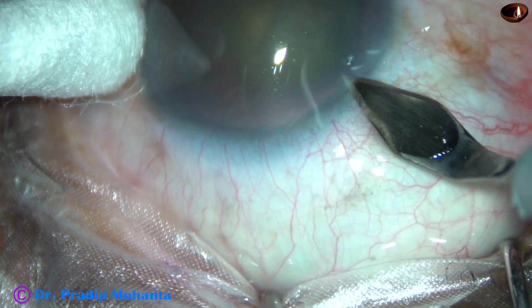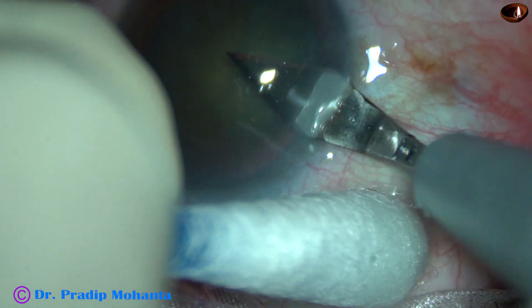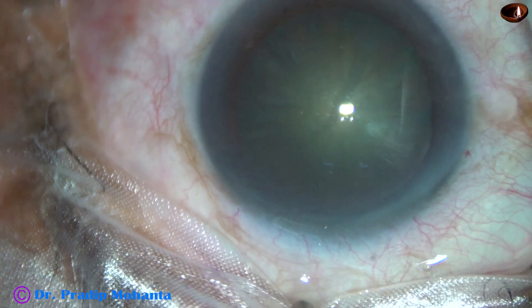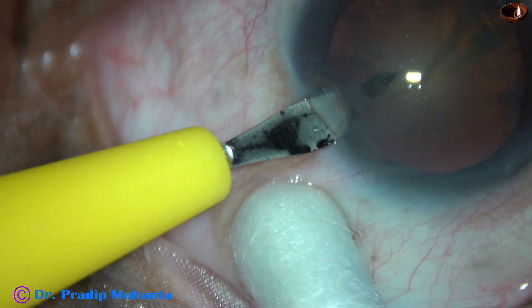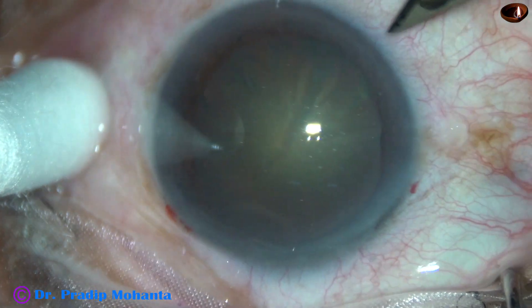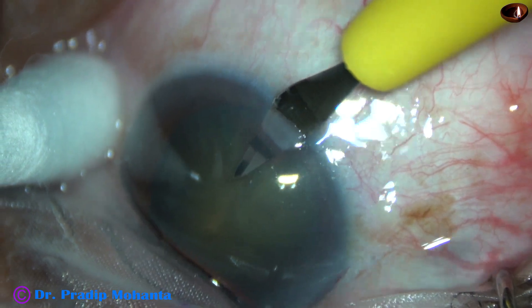This is the main incision with a 2.8 mm steel keratome on the posterior aspect of the limbus. This is a side port on the left side of the main incision, and this is another small side port on the right side of the main incision.